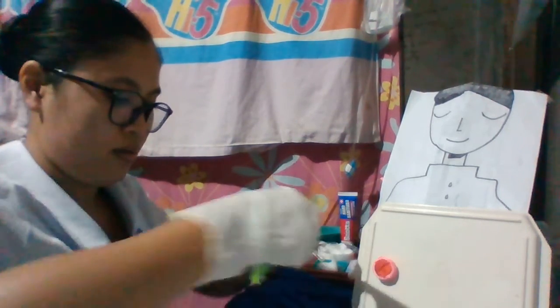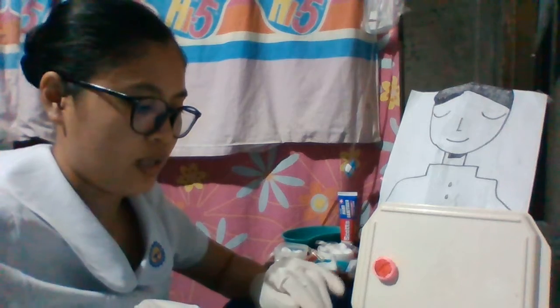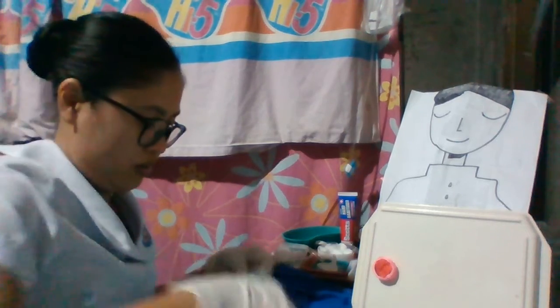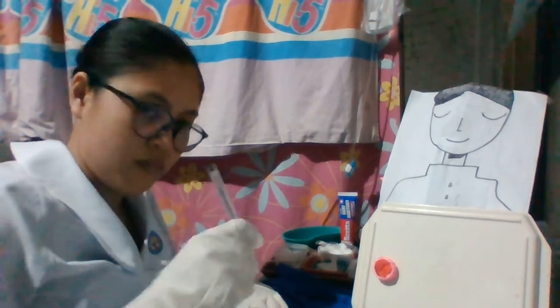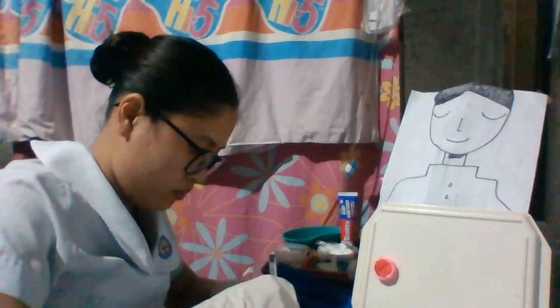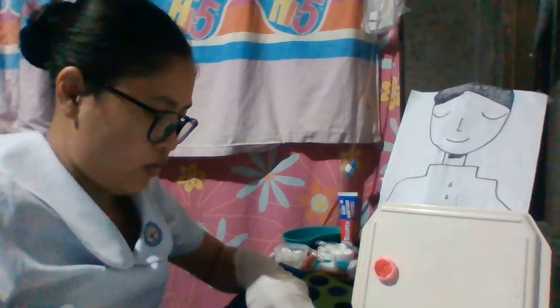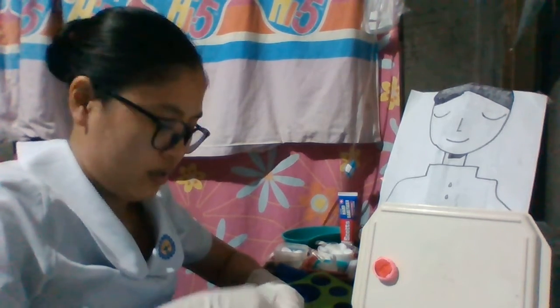So after tracing a circle the same size as the stomal opening, next, we're going to cut out the traced stoma pattern to make an opening in the skin barrier.